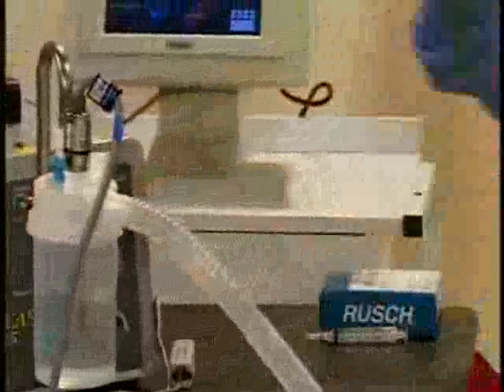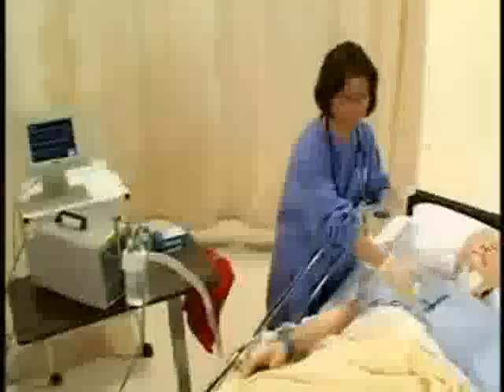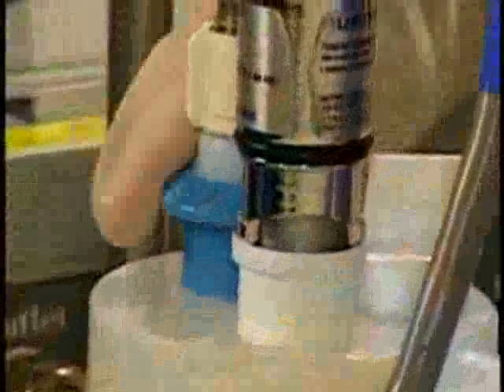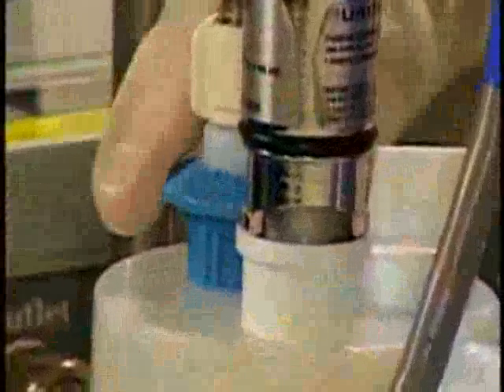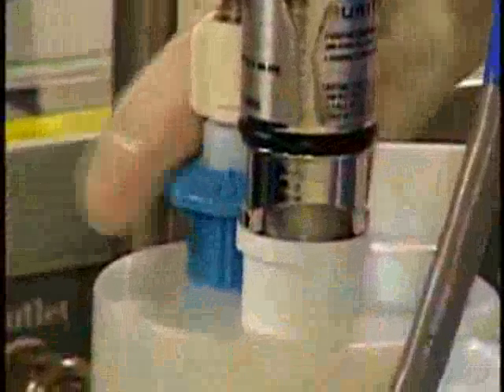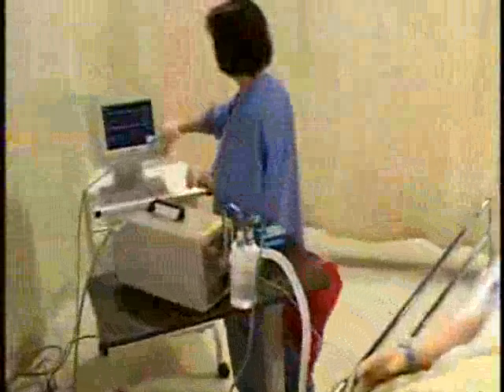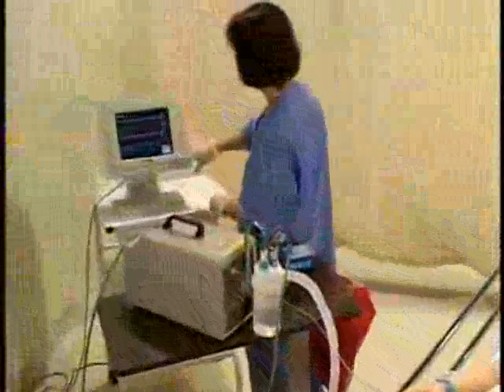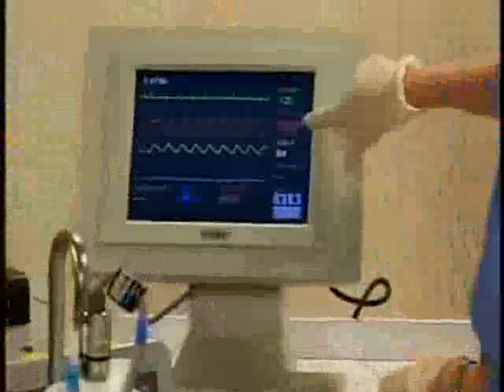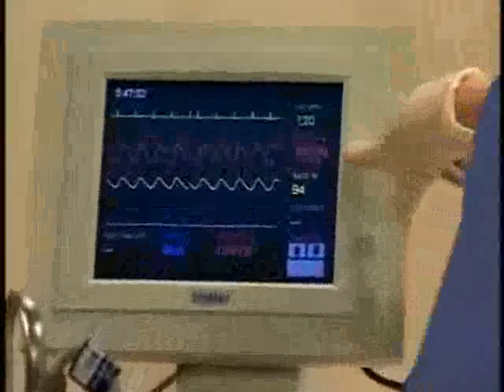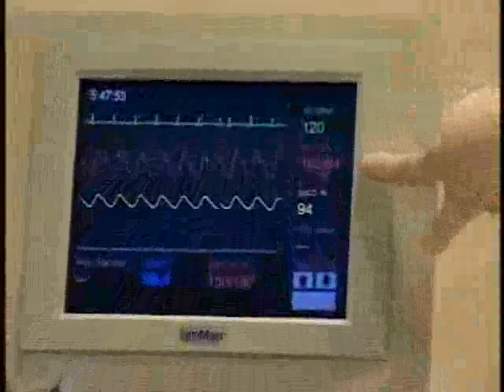Next, attach the wide-bore oxygen tubing and T-tube adapter or tracheostomy mask to the flow meter and turn it to the flow rate needed to achieve the prescribed oxygen concentration. An oxygen analyzer may be used to check the actual oxygen percentage being delivered.